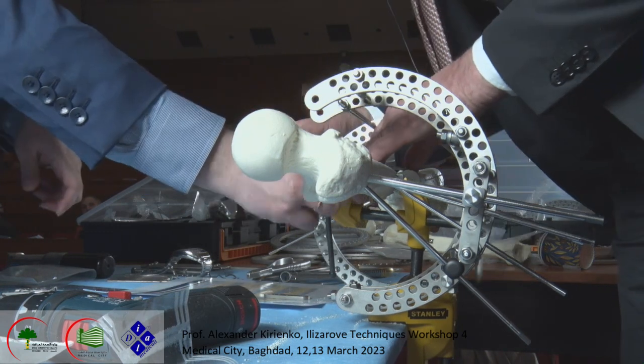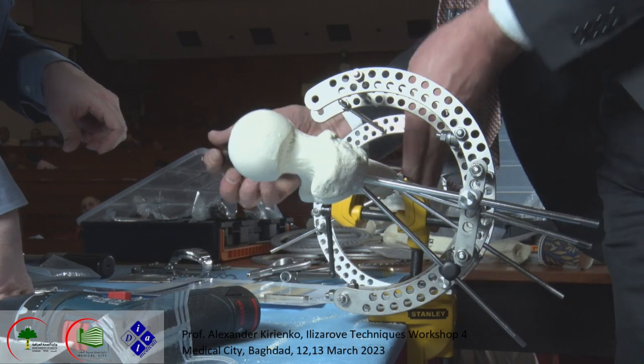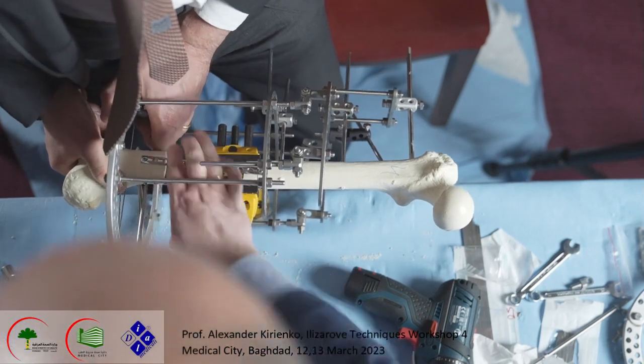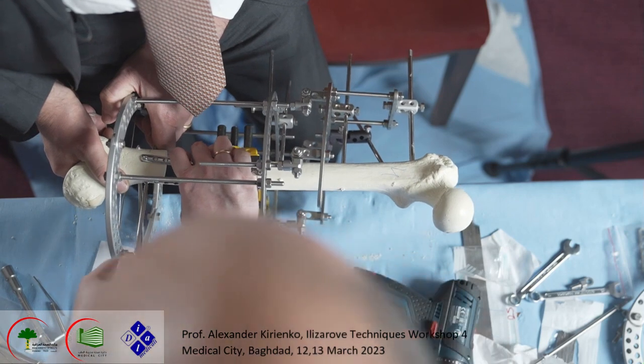Mi sa che è spanata. Un po' così obliquo. Aspetta.